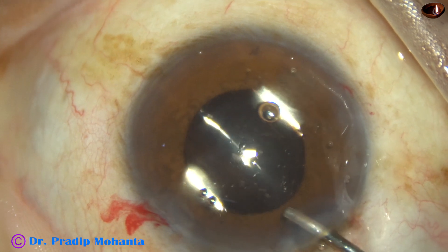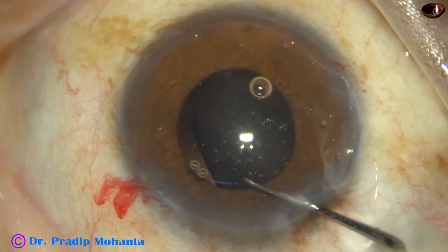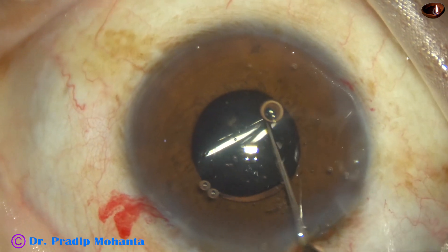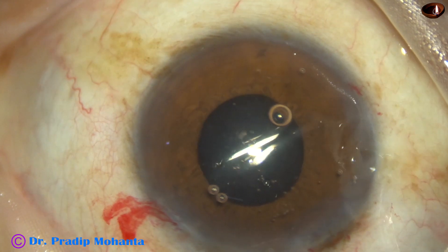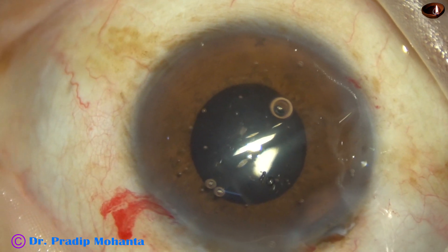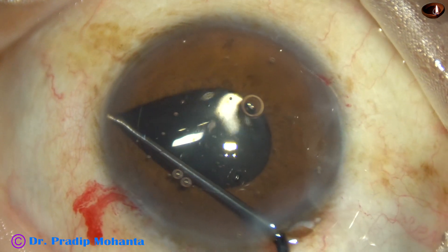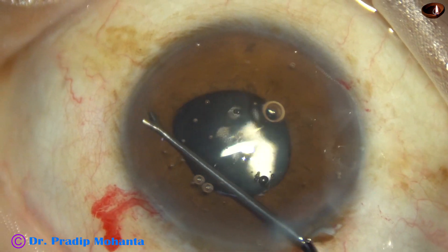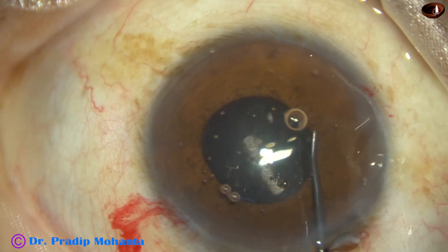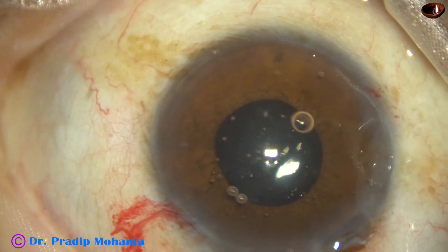The lens is delivered by screwing it out. I hope the lens has gone into the capsular bag. We have an instrument shaped like the letter Y to check whether it is in the capsular bag. The iris can be retracted very nicely by this instrument, and I can see that the lens is in the capsular bag. I go to the other haptic and find that haptic is also in the capsular bag.